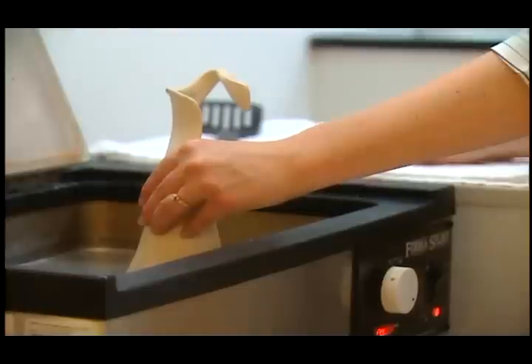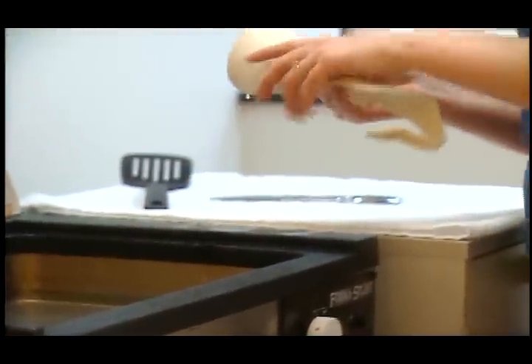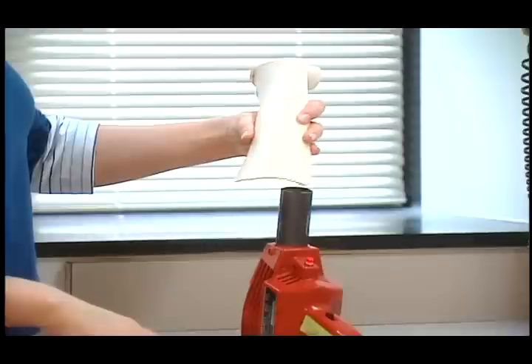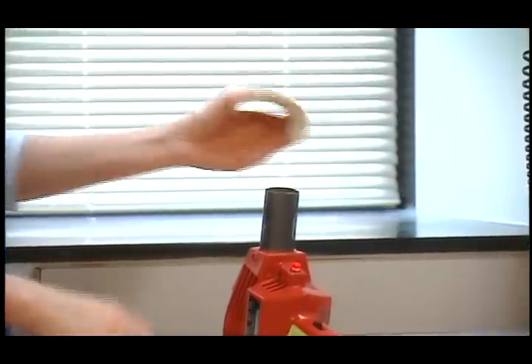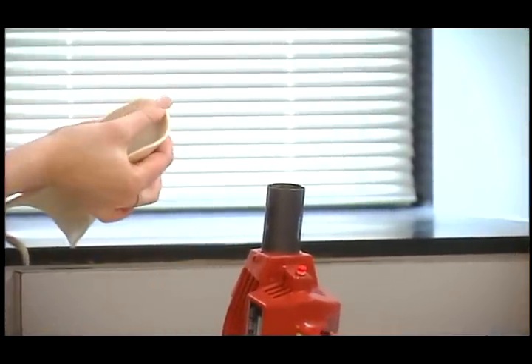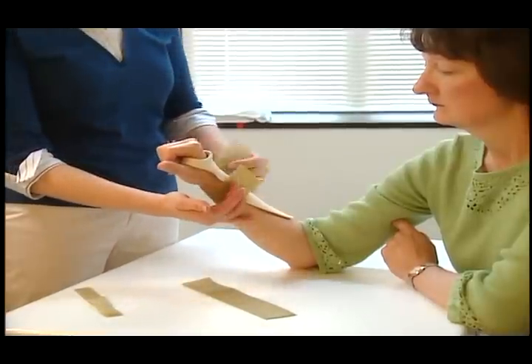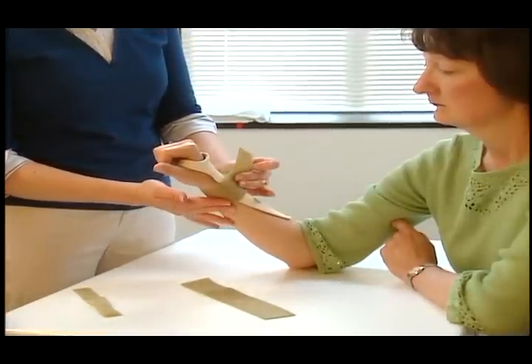Cutting the material while still slightly warm will create a nicely finished edge. Smooth edges and proper application of straps are imperative to prevent pressure points and to ensure a properly fitting splint. One way to produce a smooth edge is to dip the edge of the splint into the hot water and cut it while it is still warm. Also, heating the material briefly with a heat gun and smoothing it lightly with fingertip pressure will create a smooth edge. Strap location must be carefully planned to provide three-point pressure.